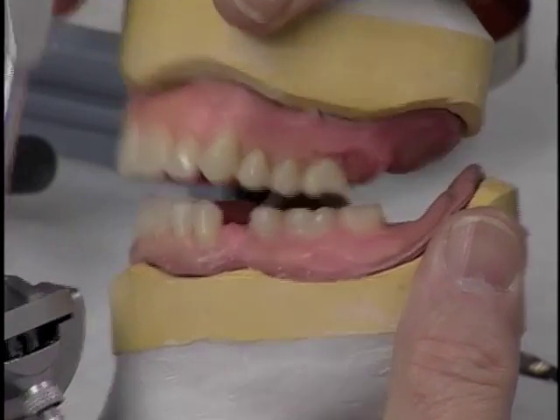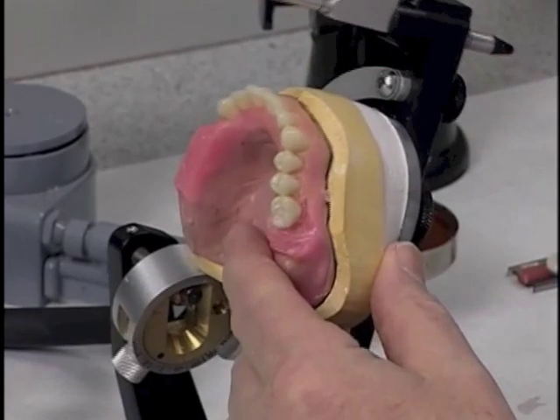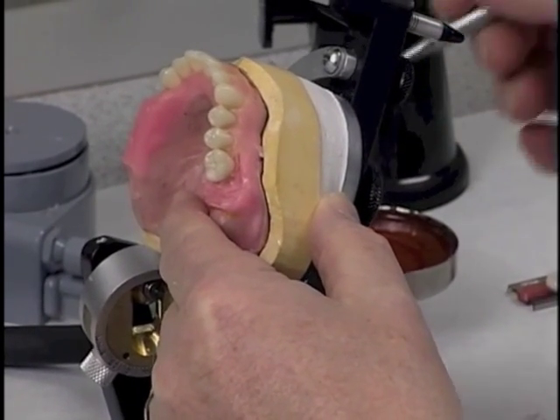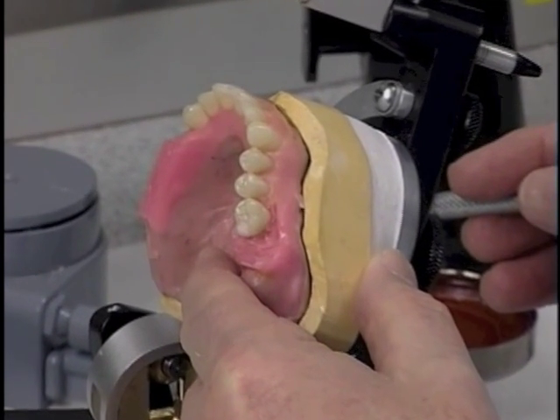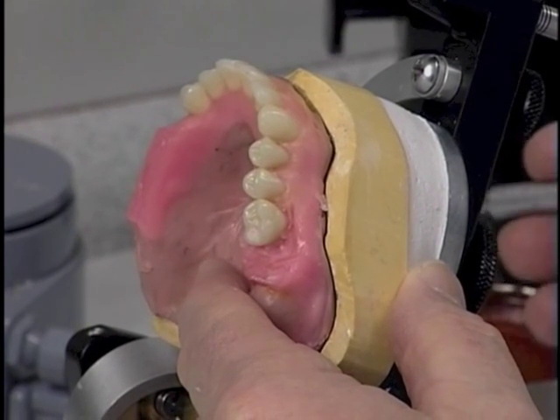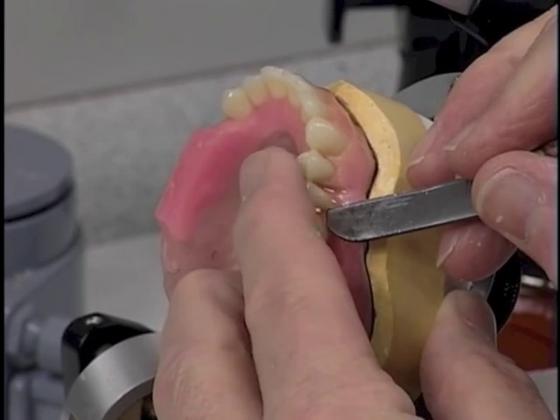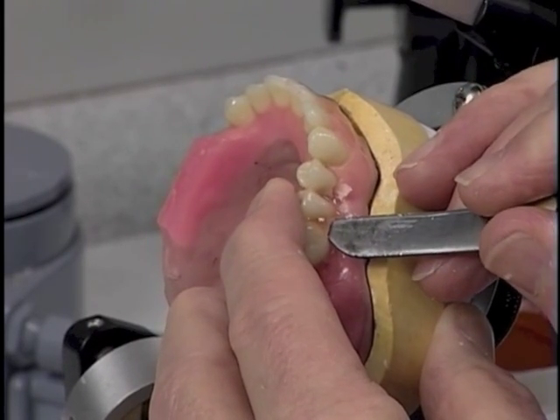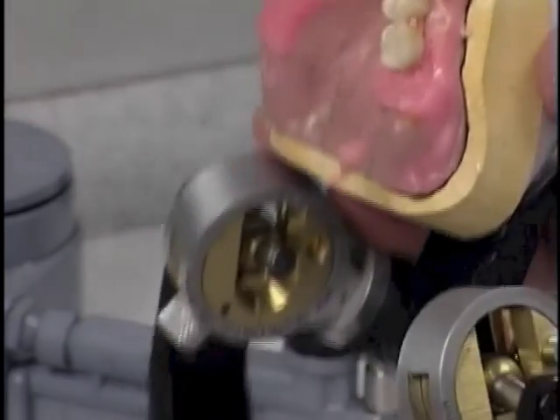So what we need to do is to work just a little bit on this maxillary second premolar, and we're going to do that by softening the wax around it a bit, and try to straighten the long axis of that tooth up to give it more of a vertical long axis rather than it having a mesial inclination. You can take a knife, a hard instrument, and literally move the tooth just a little bit. Now let's see what it does for us.